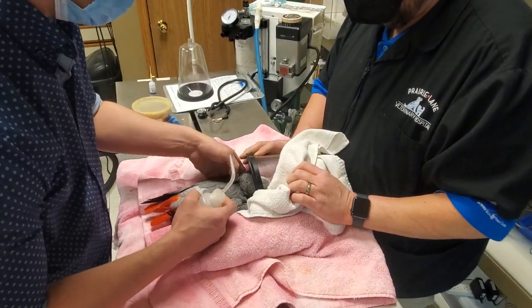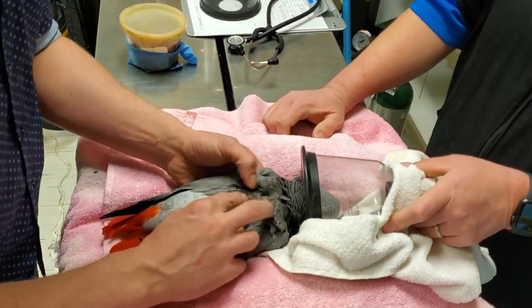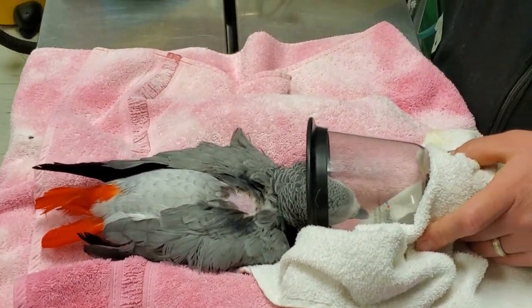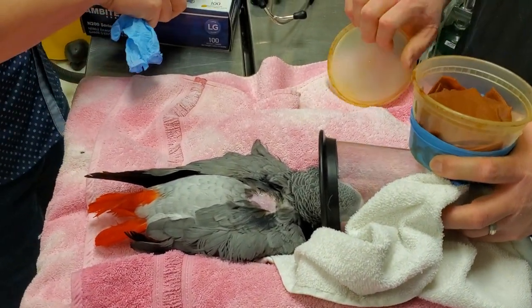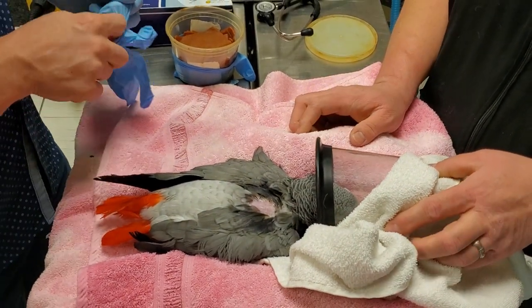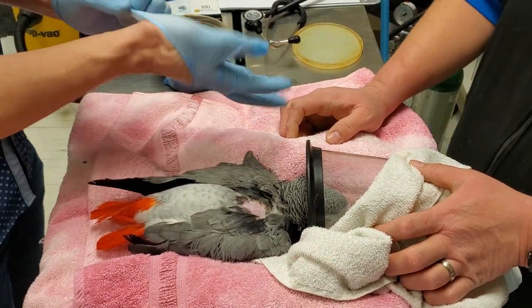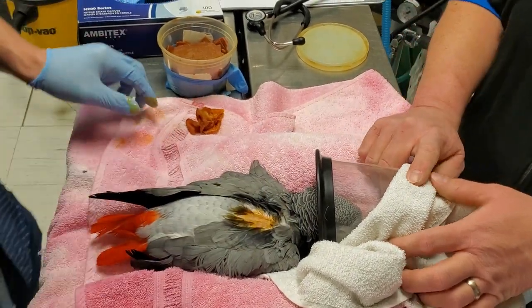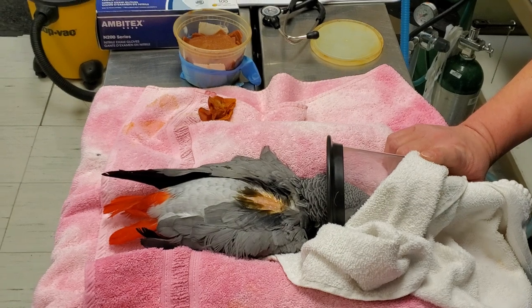Use just a bit of alcohol. Spread the feathers so that we can identify the featherless area on her back, which is just here. Then I'm going to use a set of gloves to be able to give a clean prep of that space. Very briefly, wipe once. Discard. Rinse. Alcohol. Change to the sterile gloves.